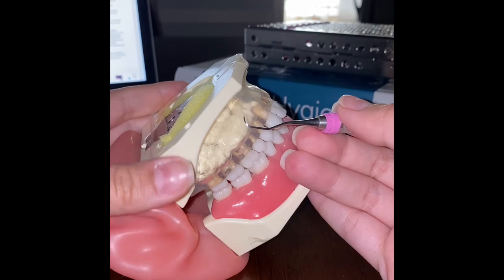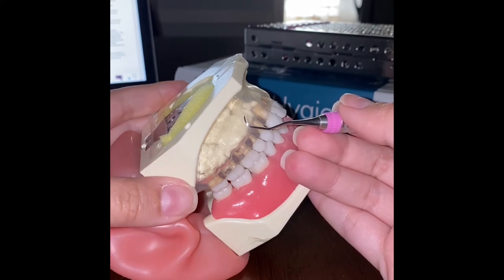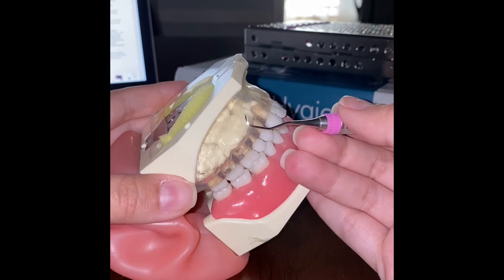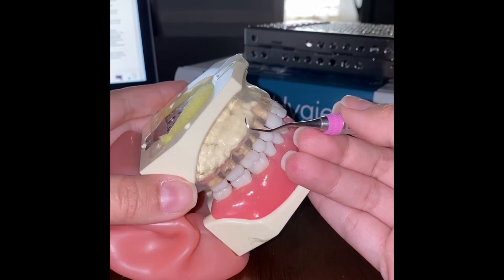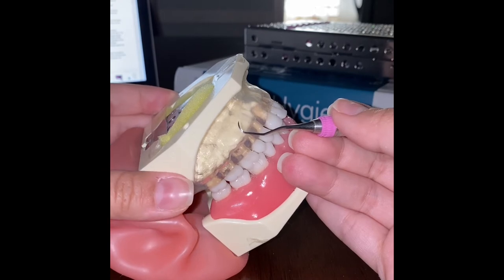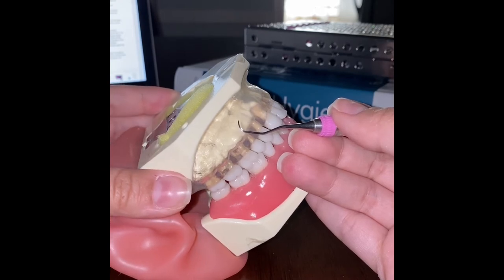Similar to the universal curette, we insert the face of the blade closed at an angle of 0 to 40 degrees. Once in the sulcus, we open the face of the blade by tipping away from the tooth. We activate this instrument using controlled overlapping strokes with moderate to firm pressure. The working end should be kept below the gingival margin at all times.